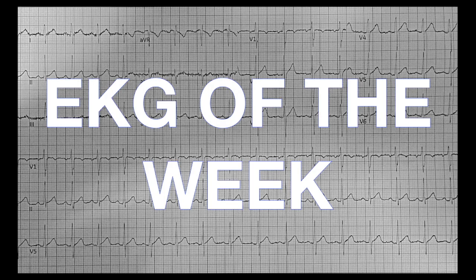EKG of the week. Welcome to a new segment that we're doing with EMS Grand Rounds. The idea is that we're going to do some hopefully relatively brief videos just walking through interpretation of EKGs. The reason for that is that EKG interpretation is probably the thing that you do as a medic that really sets you apart from most of the other, certainly pre-hospital healthcare levels of credentialing or certification or licensure, but probably also a lot from most other healthcare professionals. I mean, who else out there is really interpreting a 12-lead EKG other than physicians for the most part?